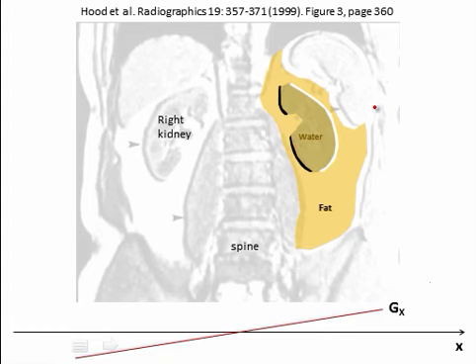Now, I say apparent because remember, the MR image is a representation of the true spin density. It's an estimate of the true spin density. We want the image to be an accurate representation of the spin density as much as possible. But for instance, when we have a chemical shift artifact like this, that's not always the case.